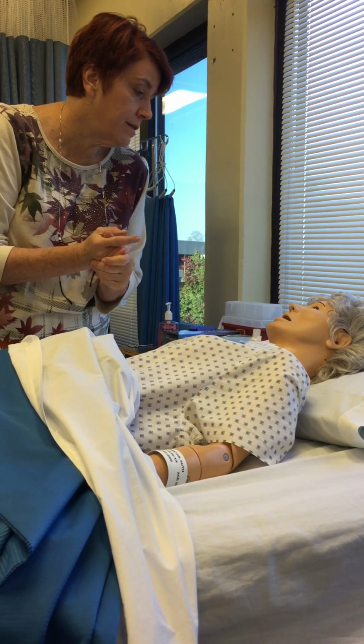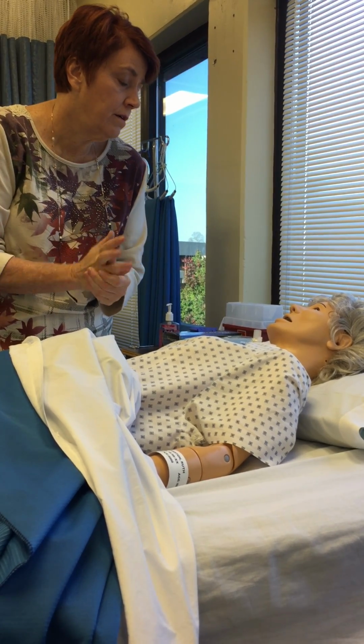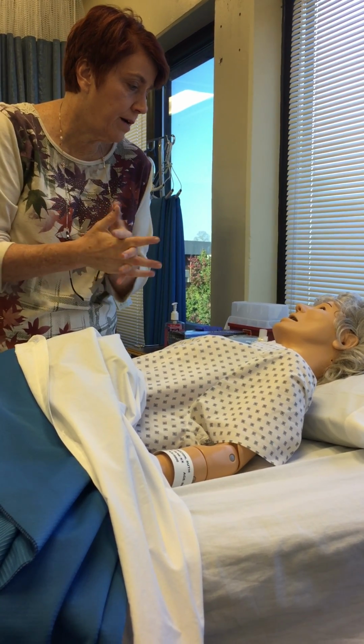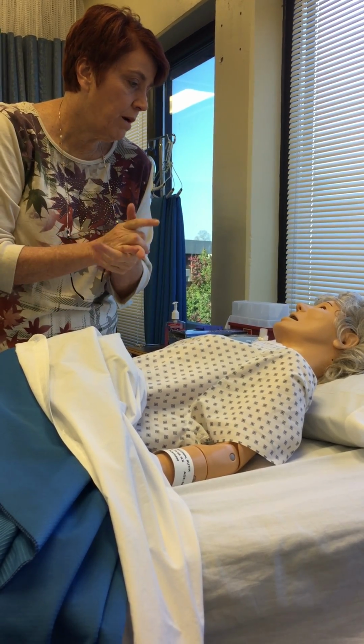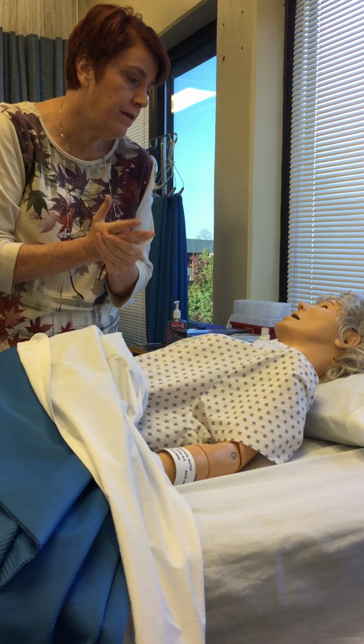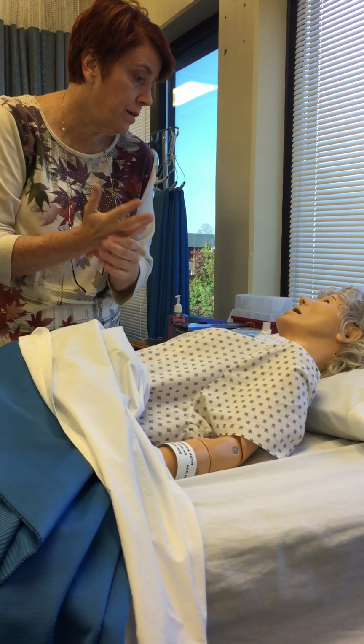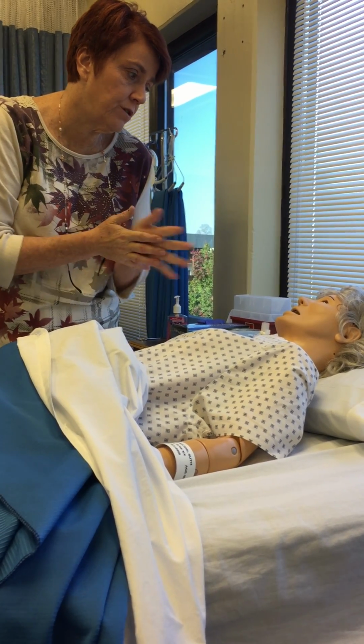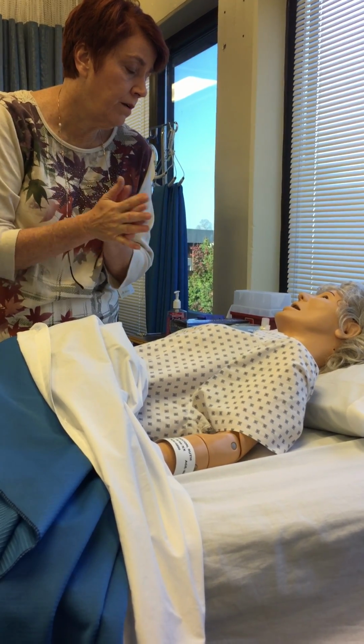Today we're going to put a catheter in you because the doctor wants to keep accurate I&O, meaning he wants to see how much urine you're putting out, because he wants to keep extra close track of your fluid status. It'll probably just stay in there for today, maybe today and tomorrow. We don't want to leave catheters in very long because they're a good source of infection if we don't take very good care of them.